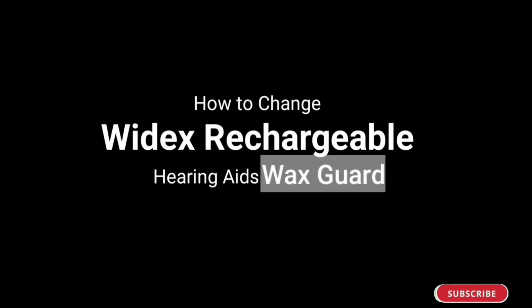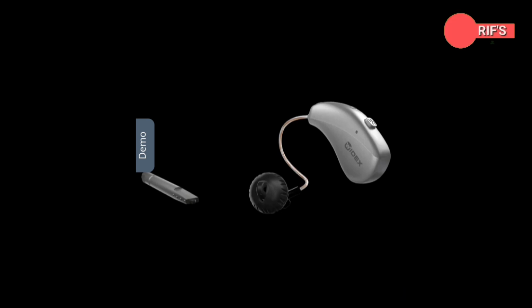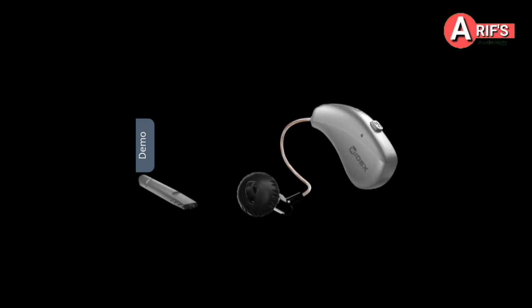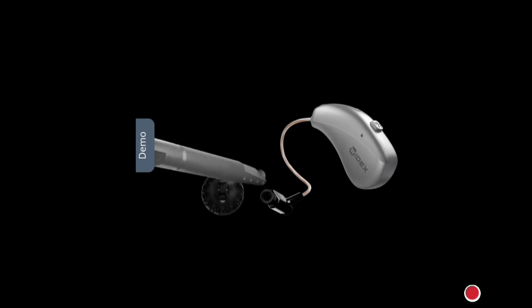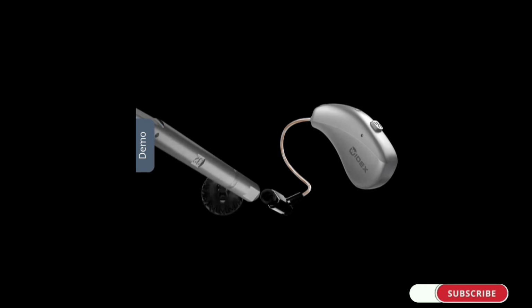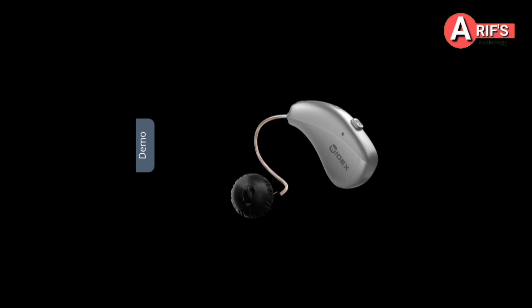So let me explain how to change the wax guard of Widex rechargeable hearing aids. First, you need to take out the dome from the receiver. Once you take out the receiver's dome, take one stick from the wax guard kit. From one end take out the older wax guard, and from the other end you have a new wax guard. Place it, and replace the same dome back.